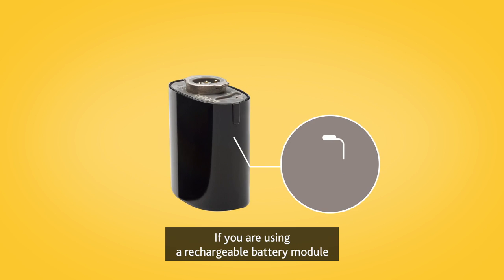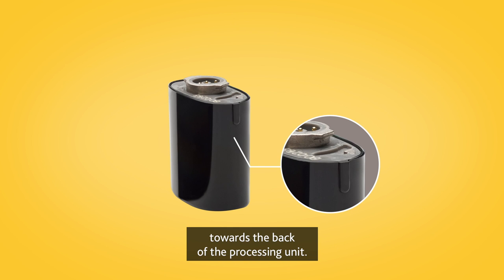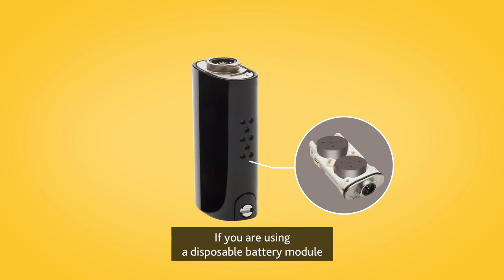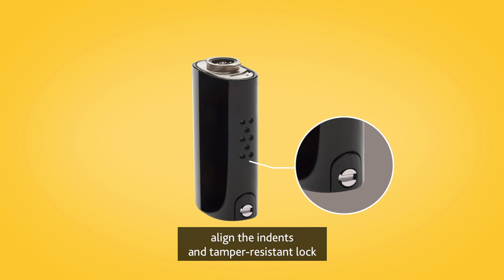If you are using a rechargeable battery module, align the raised marker and arrows towards the back of the processing unit. If you are using a disposable battery module, align the indents and tamper-resistant lock towards the back of the processing unit.